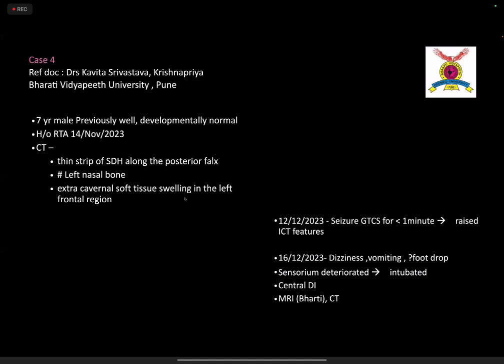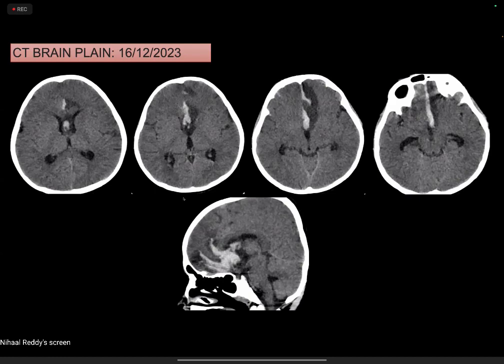We did an MRI a little late, actually, not initially during the admission because he was not hemodynamically stable. And the MRI is for the discussion. The CT, was it done? I have a CT. CT was done outside. The initial admission was outside. We don't have the other images, only these many images I have, sir.